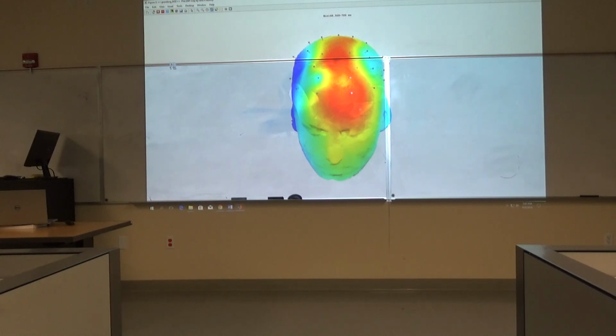No, okay, you keep the colors. Colors are going to be mistakes. But you can play around, yeah. Oh, you got it over here too, huh? You got it? Works? All right. 60.